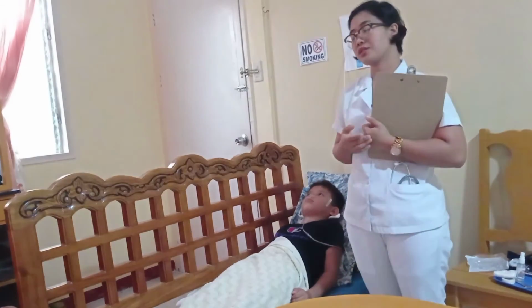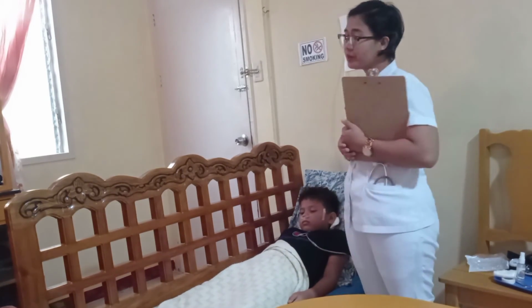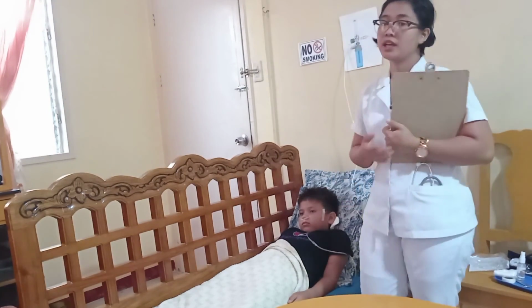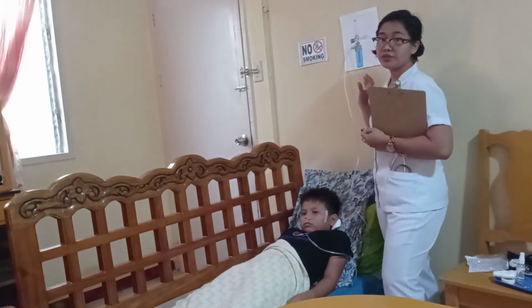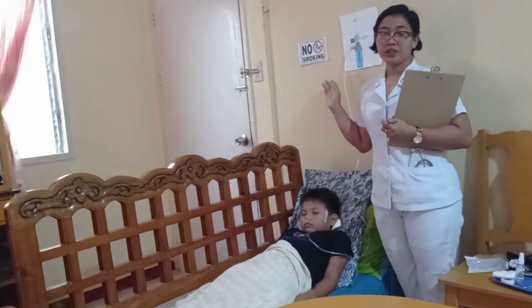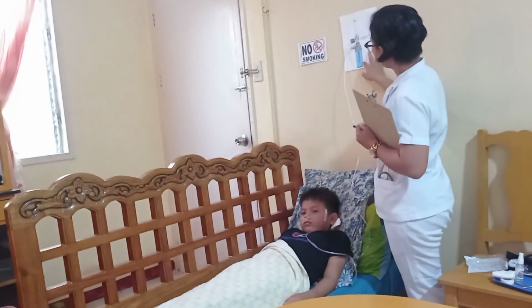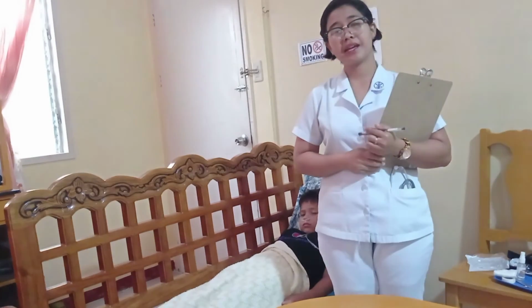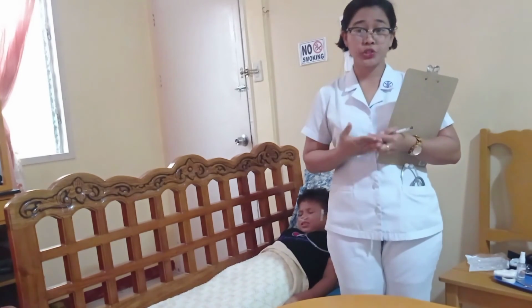There's no creation of flammable materials inside. The tank stays upright. Then I am also going to check the liter flow and the level of water in the humidifier. We are still on the baseline part. The rationale for this is to ensure the safety of the patient and significant others.